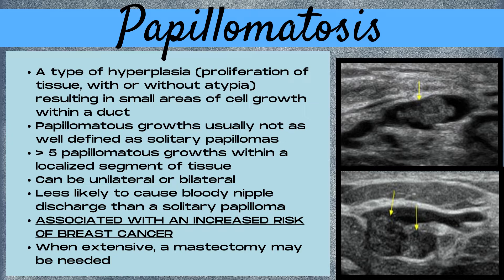Note that papillomatosis is associated with an increased risk of breast cancer, and when extensive, a mastectomy may be needed. On ultrasound, papillomatosis will appear as solid material that is ill-defined as separate masses within a duct, with associated characteristic hypervascularity. When extensive, you may see this throughout many ducts and many segments of the breast tissue.